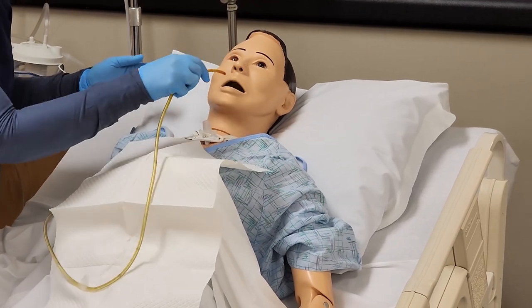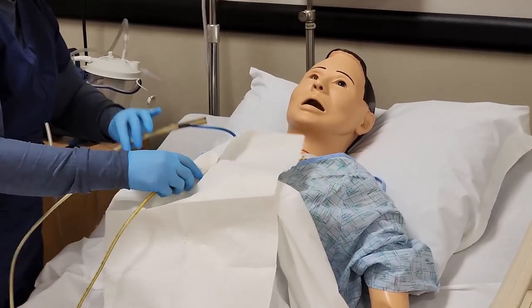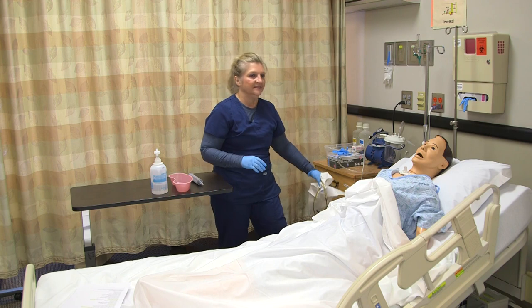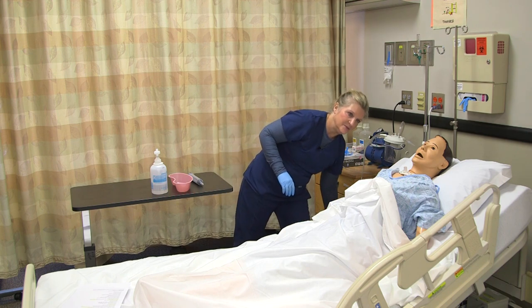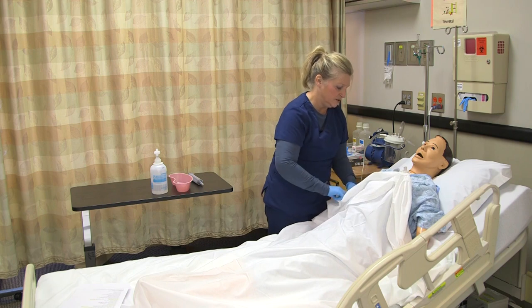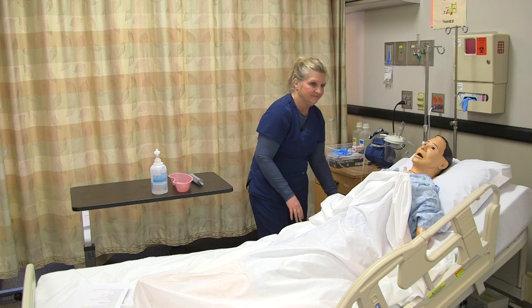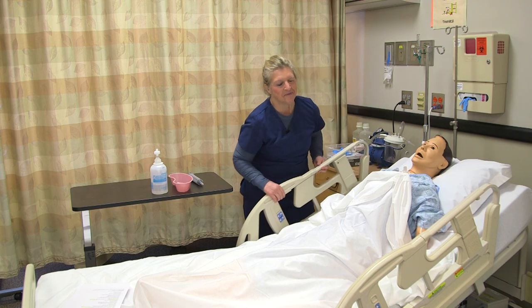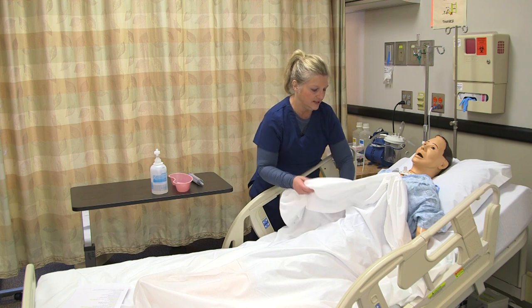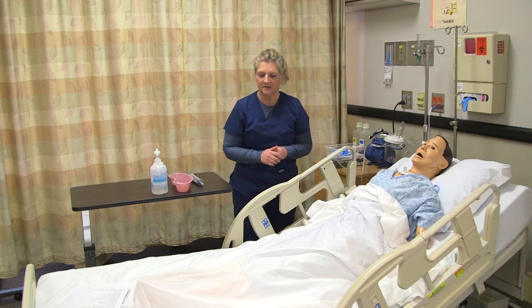Once it comes out, you can go ahead and place it in the disposal receptacle and dispose of it as appropriate. Then I'm going to assist the patient to a comfortable position, remove my gloves, put the side rails up and the bed down, ask the patient if there's anything they need, and promote your culture of safety with a call light.